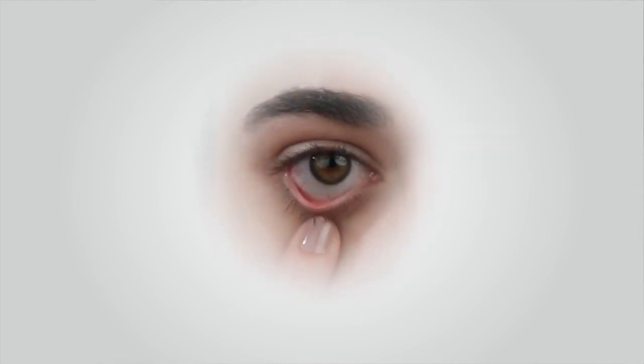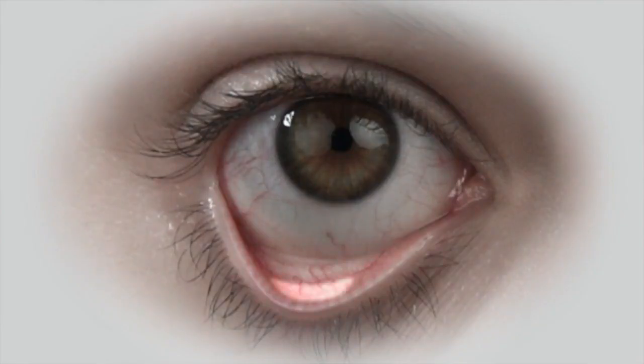Hold the patient's lower eyelid down to invert the eyelid and expose the pocket. The highlighted area shows the conjunctiva where the iPen sensors should be placed. Avoid touching the lid margin. Immersing the sensor in the lower tear meniscus should also be avoided. Do not touch the sclera.